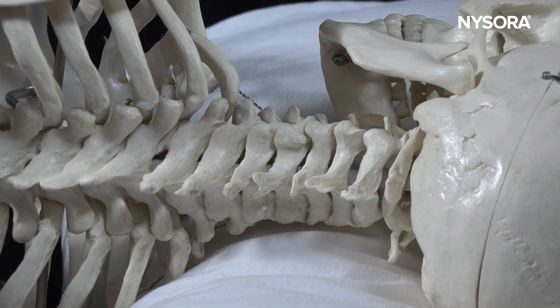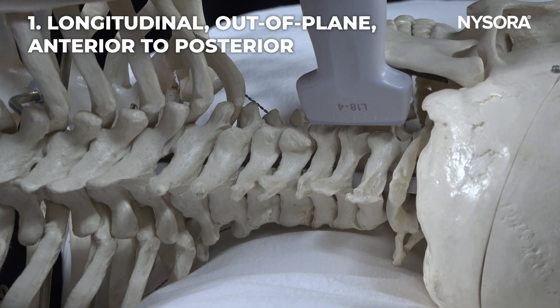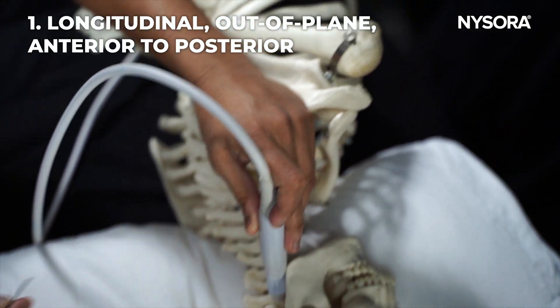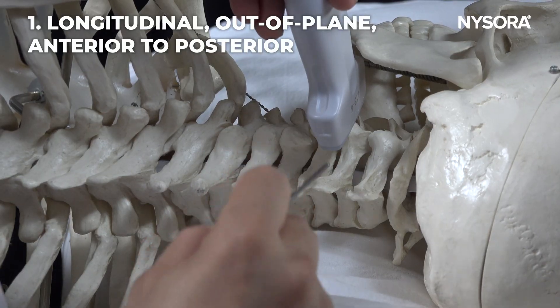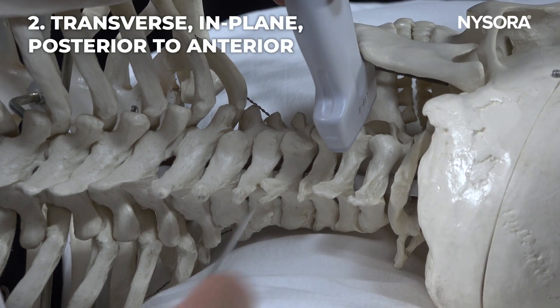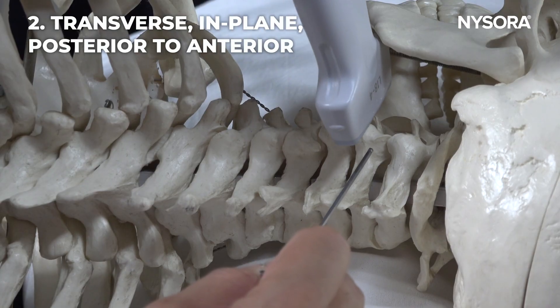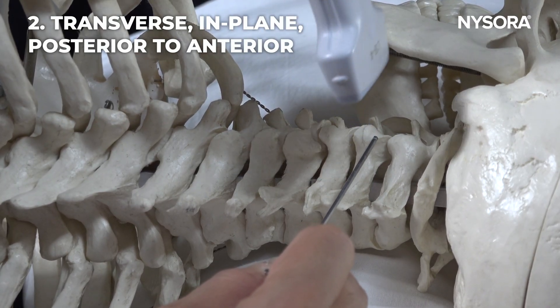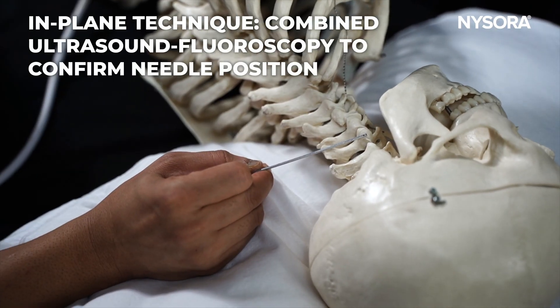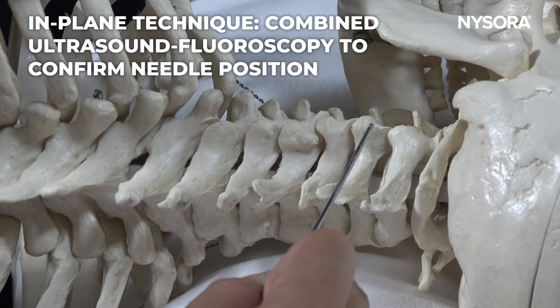There are two ways to perform the injection. You can do it in a longitudinal view with an out-of-plane technique going from anterior to posterior, or you can do a transverse view with an in-plane technique. The advantage of the transverse view is that you can see the needle tip and identify any blood vessels. This same technique can be used for radiofrequency treatment. I call this the combined ultrasound fluoroscopy technique, or CUFF technique.